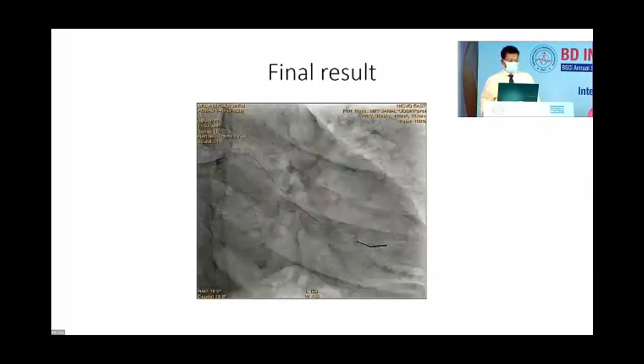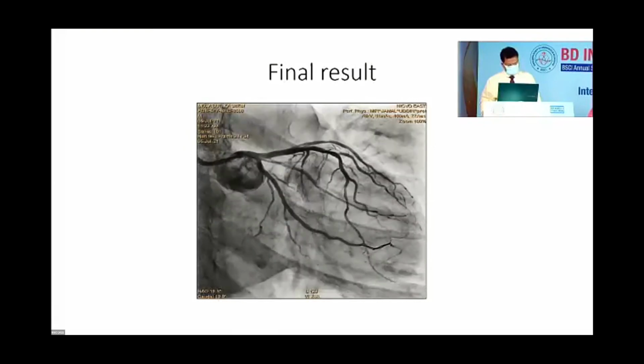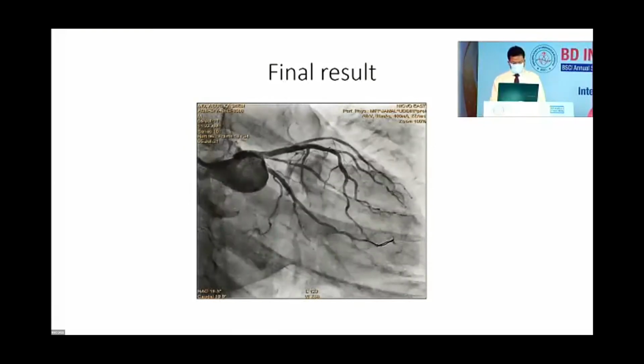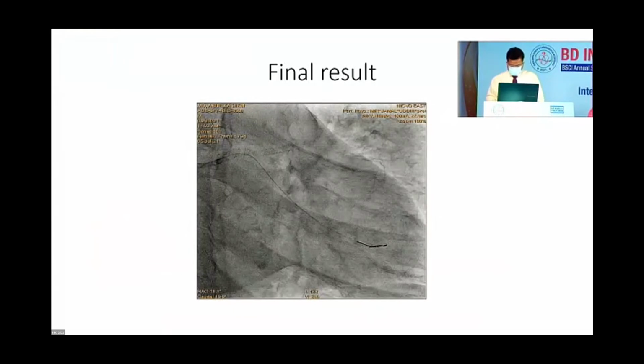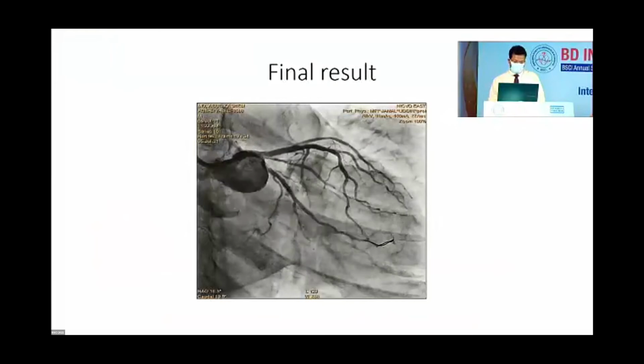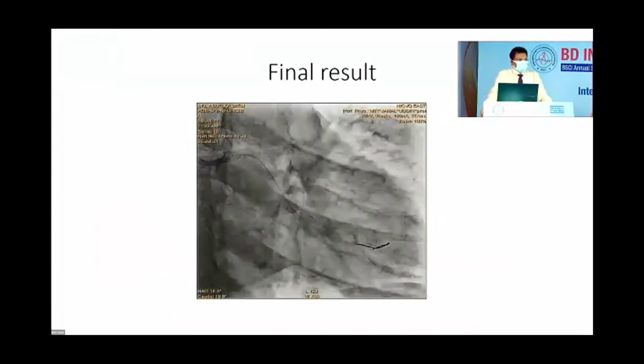Many parts of the left main are uncovered because of the deformed stent, so there are many chances of ISR. There will be an increased possibility of ISRs. Moreover, the hanging part of the stent may predispose to thrombus, thrombosis, and even sudden death. So it is better to cover it.